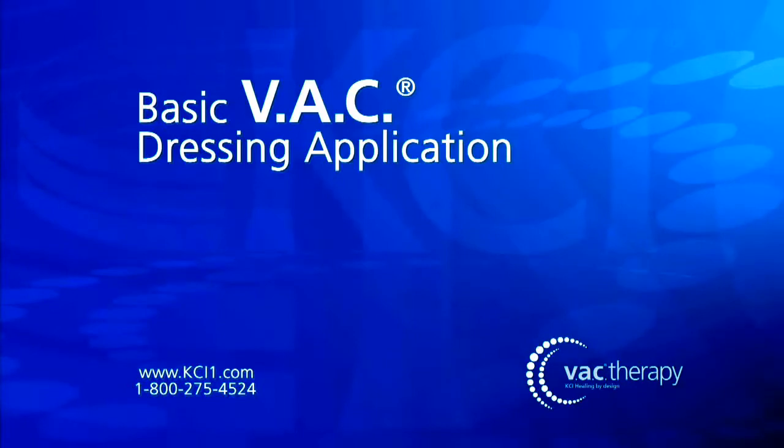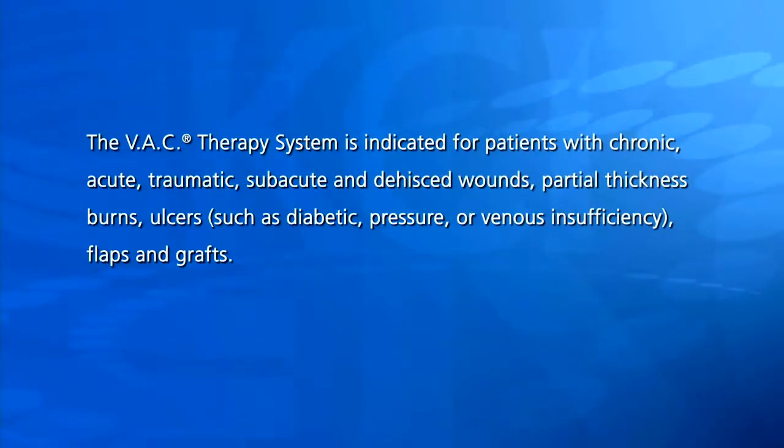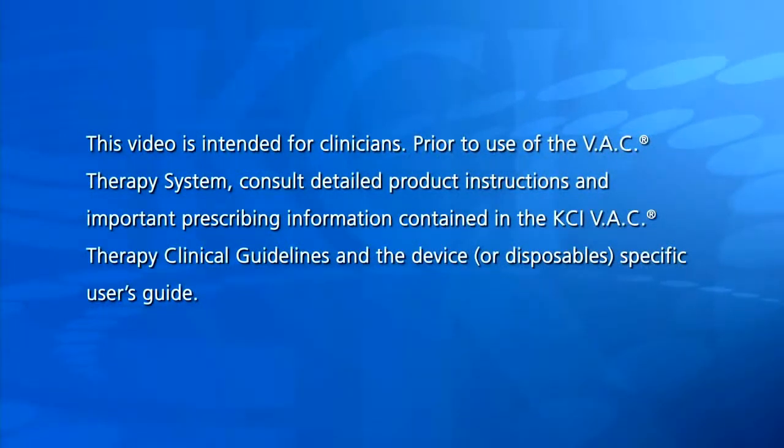KCI Basic VAC Dressing Application. The VAC therapy system is indicated for patients with chronic, acute, traumatic, subacute, and dehisced wounds, partial thickness burns, ulcers such as diabetic, pressure, or venous insufficiency, flaps, and grafts. This video is intended for clinicians.